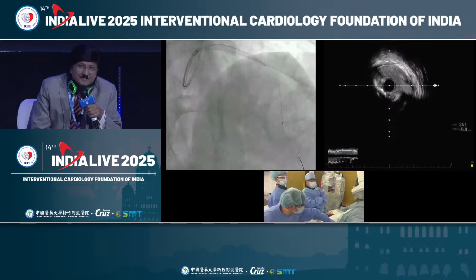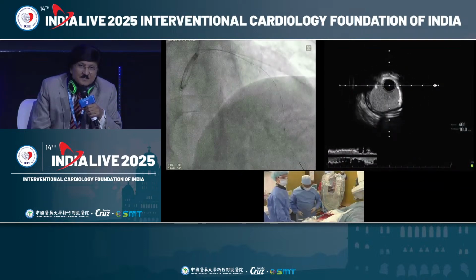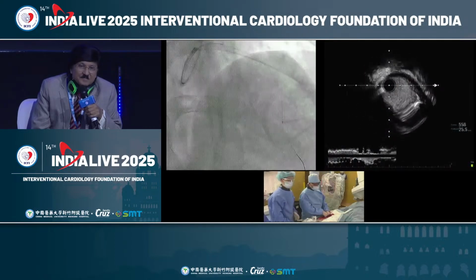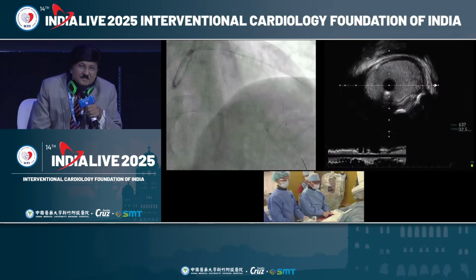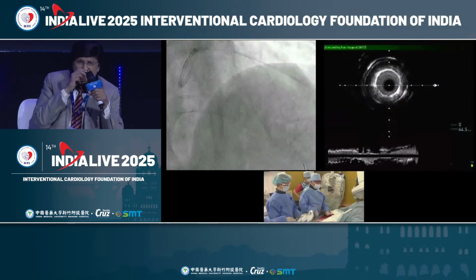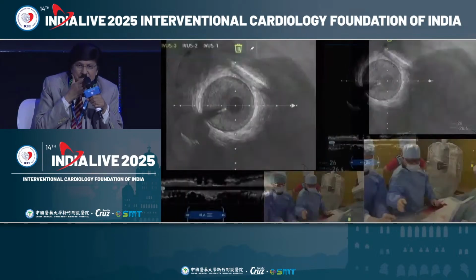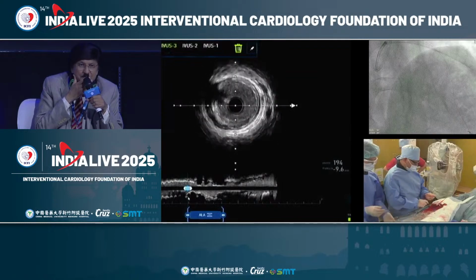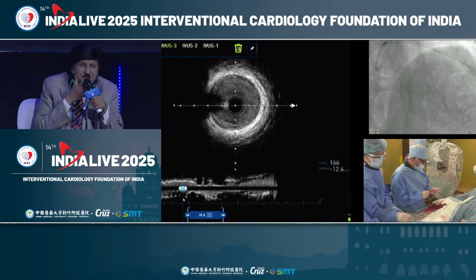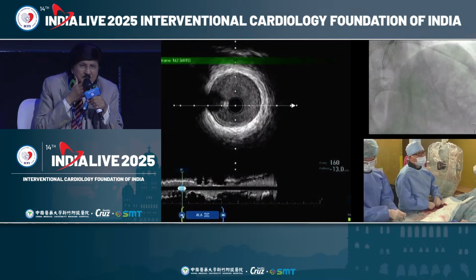Please. Okay, so this is the IVUS picture after the 2.0 burr. Yes, very nice. The calcium is well abraded compared with the previous one. We also always check whether vessel injury occurs or not at the proximal part. Please explain. Okay, let's review the IVUS quickly. This is a different vessel site, the fourth diagonal branch, and the distal landing zone is here, after the fourth diagonal branch.